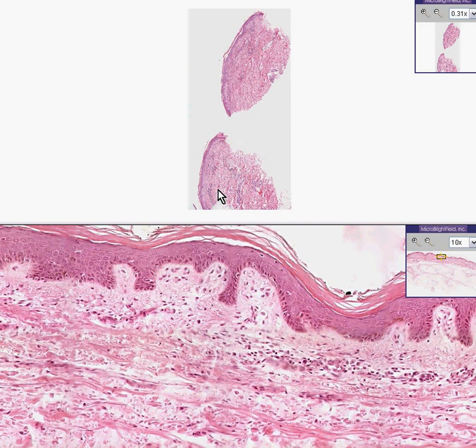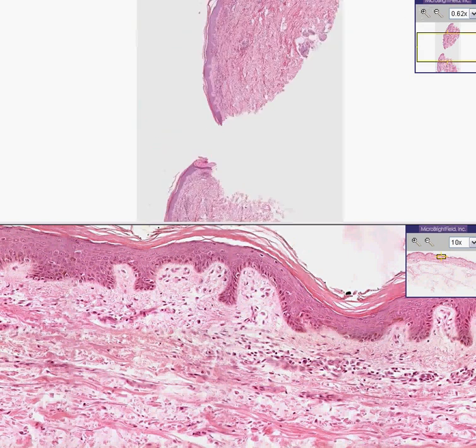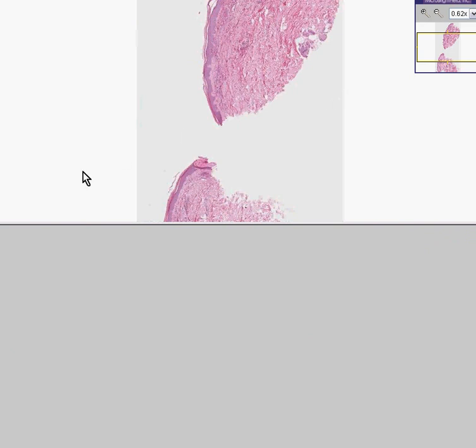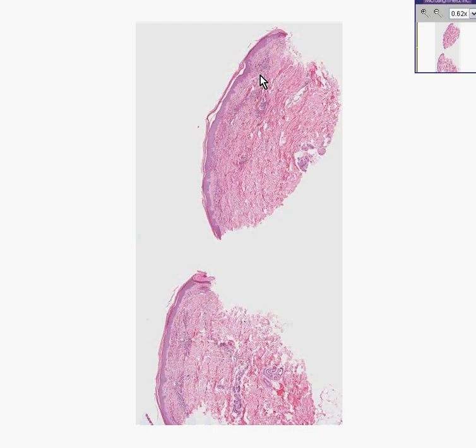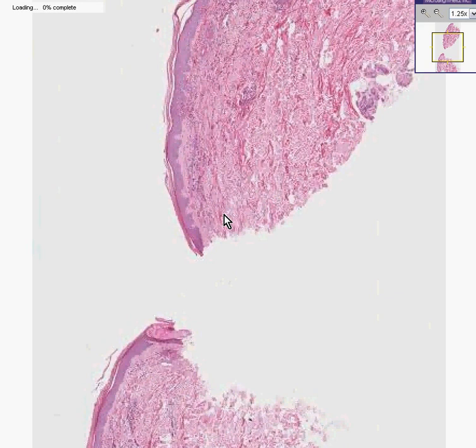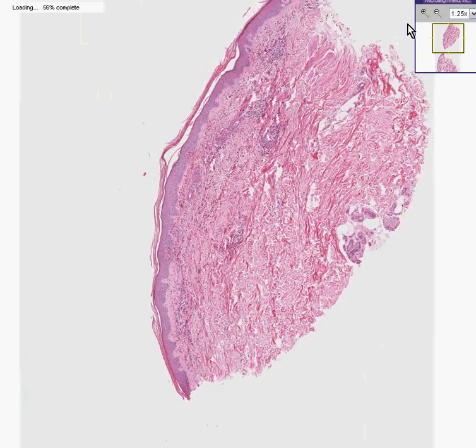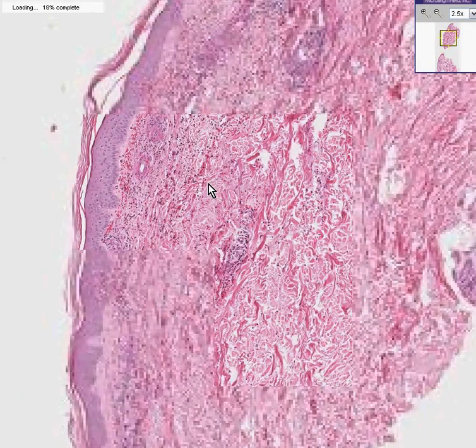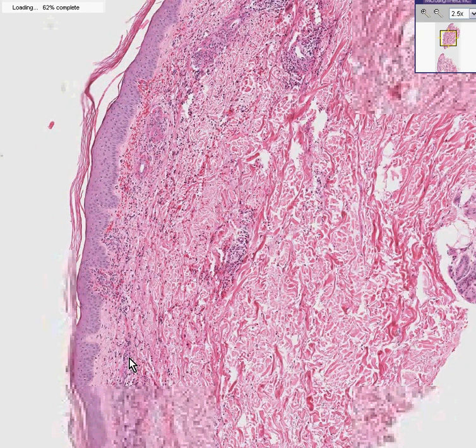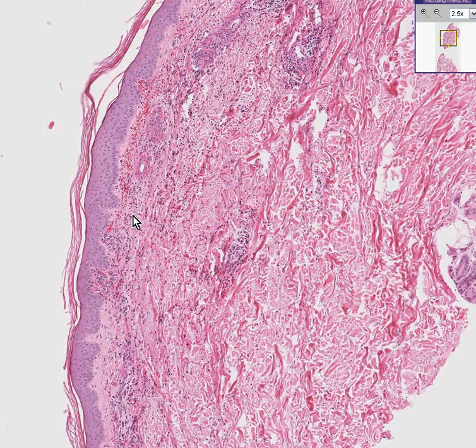Let's take a look at this skin lesion on top. This was a purplish lesion, perhaps looking like a petechiae that was cut right down the center, so there's one half and there's the other half. Notice in this particular skin biopsy that there is more than just an occasional scattered inflammatory cell in the dermis — there appear to be large numbers of them throughout. This is an inflammatory skin lesion.